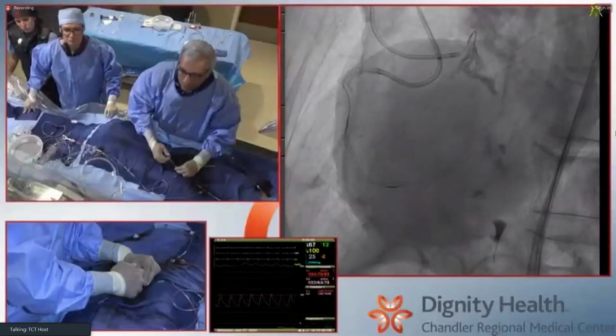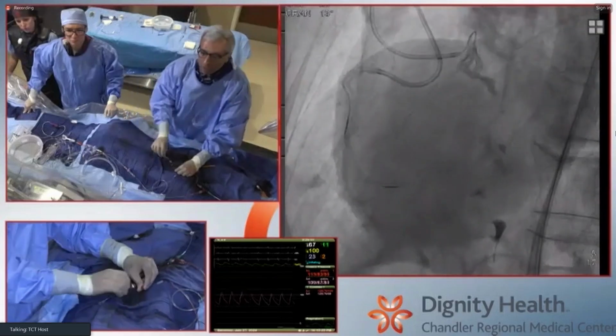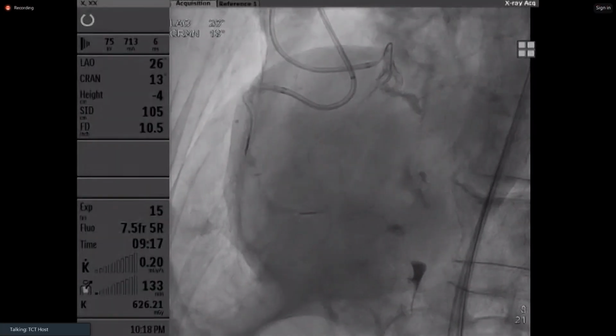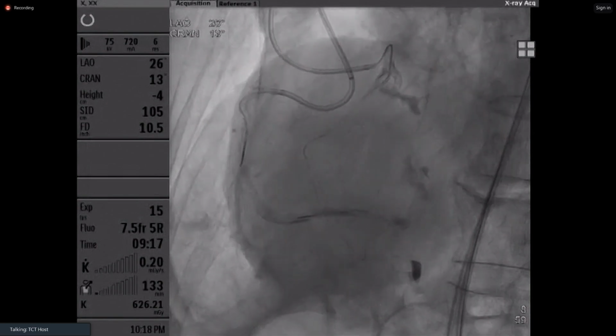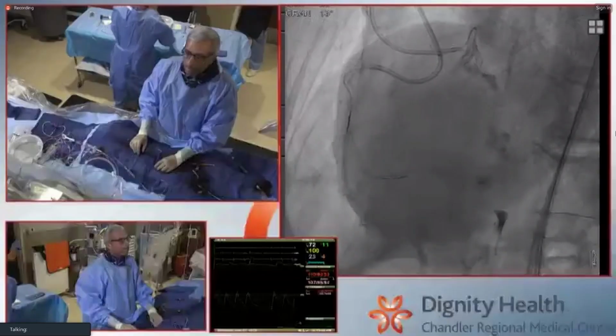I think if you are somehow with a heavy calcified RCA at the bend, where you are moving forward, if you are not able to move forward, you can try the Fielder XT. This is what I will prefer to start with in this long, heavy calcified segment.